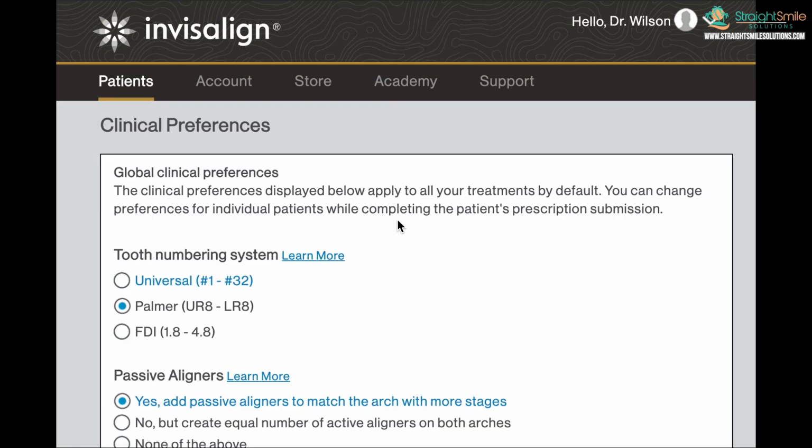This is Dr. Amanda from StraightSmile Solutions, and today I'm going to be going over how to set up your Invisalign clinical preferences. Now, quick disclaimer, this is how I would set mine up. This is how I help my clients set theirs up. That doesn't mean it's necessarily the right way for you. Every orthodontist that you talk to might have a different way and a different translation, so I think you shouldn't stress out about it, to be really honest. This is just kind of what this stuff means.